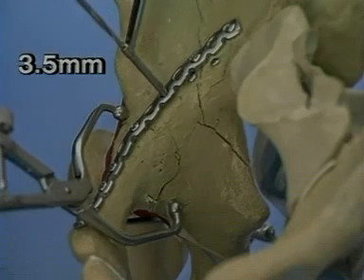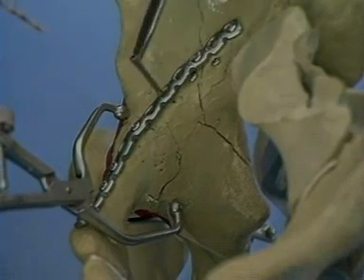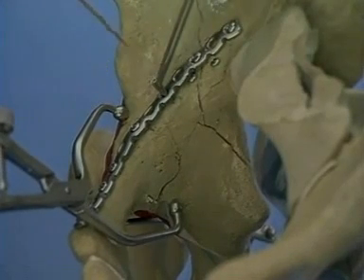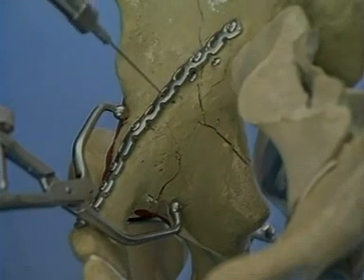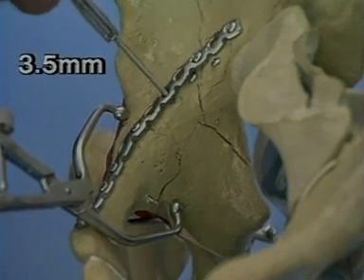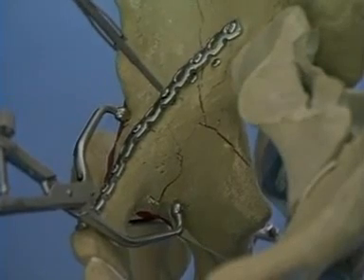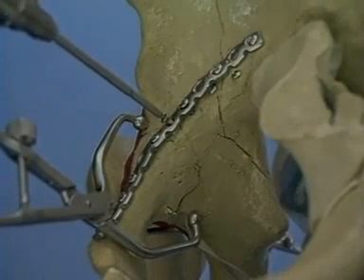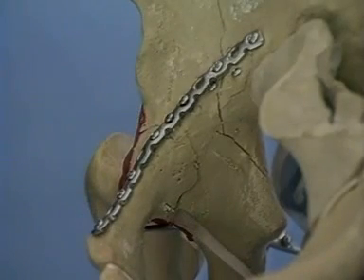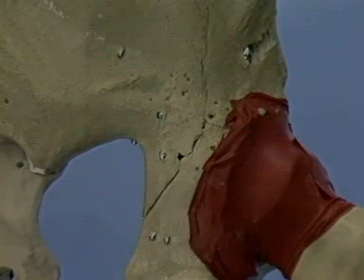Three-point-five mm lag screws are now placed through the plate holes into the posterior column. These screws must closely parallel the quadrilateral surface in order to avoid entering the joint. The 3.5 mm drill bit is first used for a gliding hole, followed by the 2.5 mm drill bit. The depth is measured and the screw inserted. The path of the screw is slightly proximal and medial to the joint. On the outer aspect of the bone, the screws fixing the posterior column are seen to exit the retroacetabular surface just above the ischial spine.